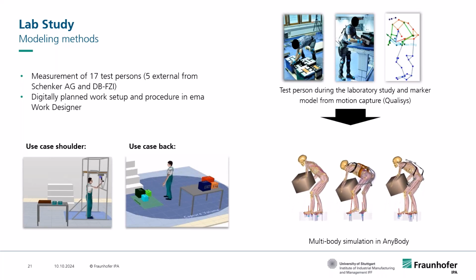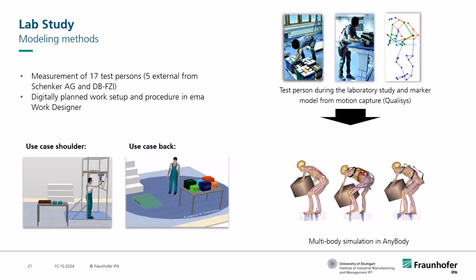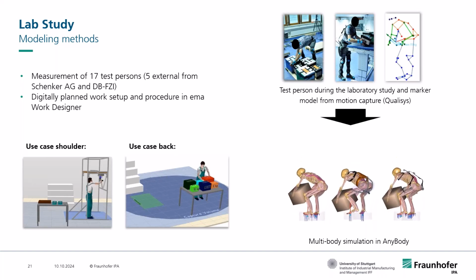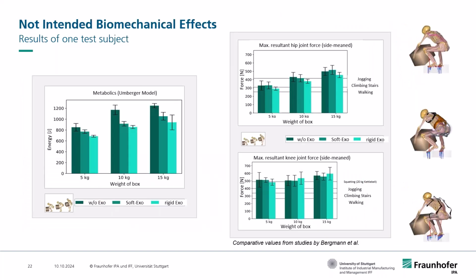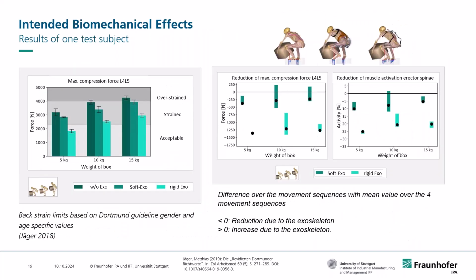So why the AnyBody modeling system to evaluate occupational exoskeletons? Mainly because you can have a look at so-called intended biomechanical effects, the intended effects for back exoskeletons.